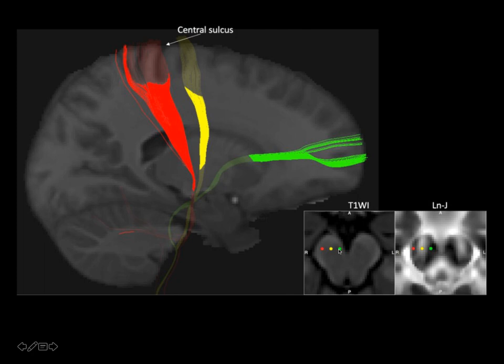So at the level of the cerebral peduncle, we see some subdomains: a medial one here, an intermediate one here, and a lateral one here, and they have different behavior, okay? So this is normal. This one is severely hypoplasic, and this lateral one is hypoplasic. If we do tractography from these seeds, we go in very different directions in the brain. And in particular, this medial part is a very well-known pathway that connects the frontal lobe to the pons.